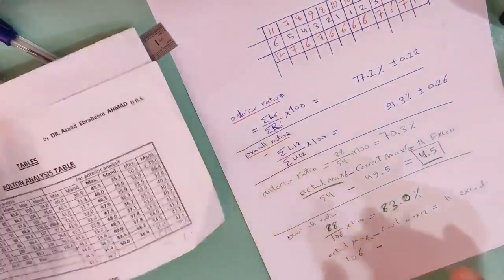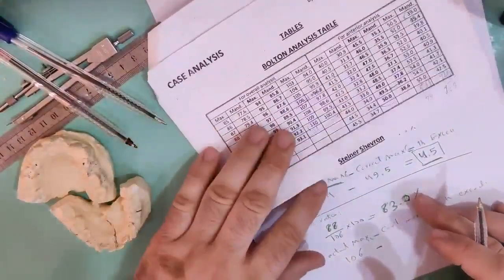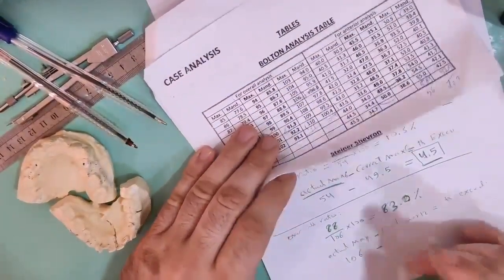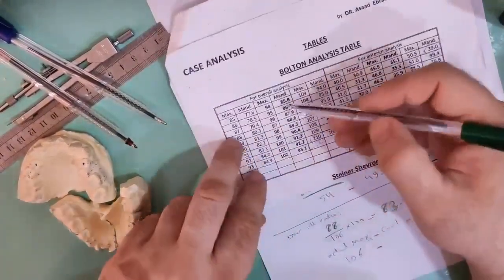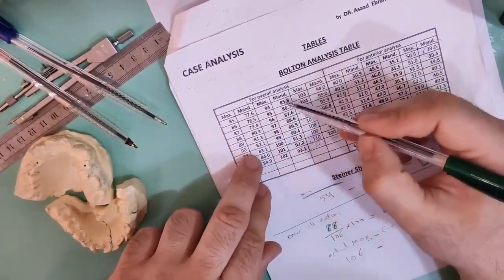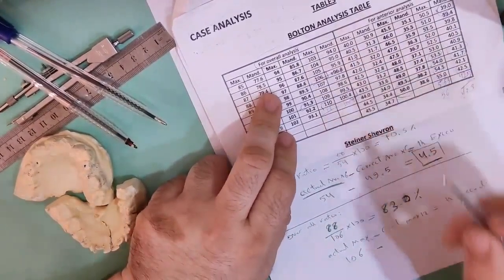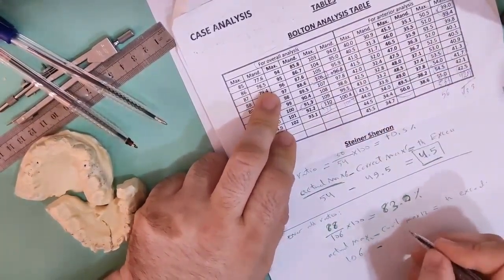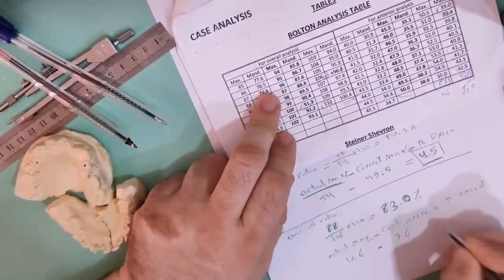It's still under 91. So for mandible 88, the maxilla should be 96.